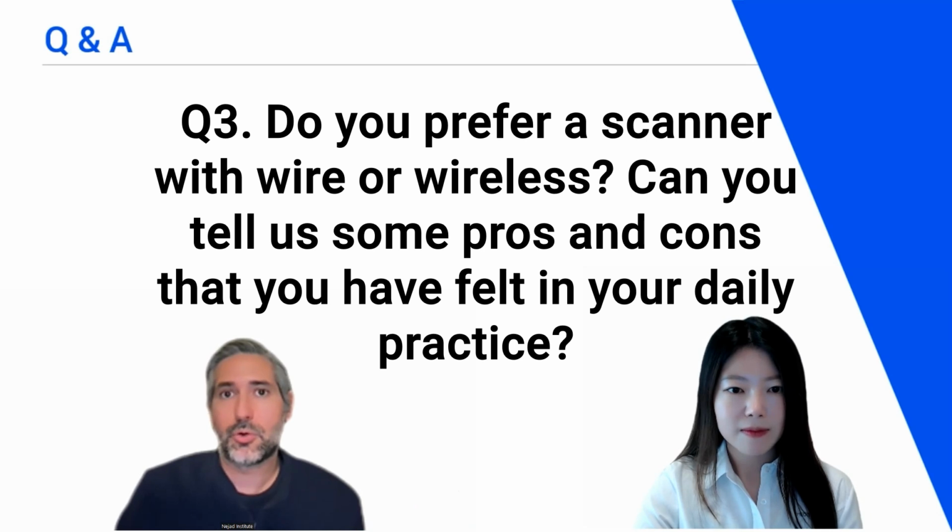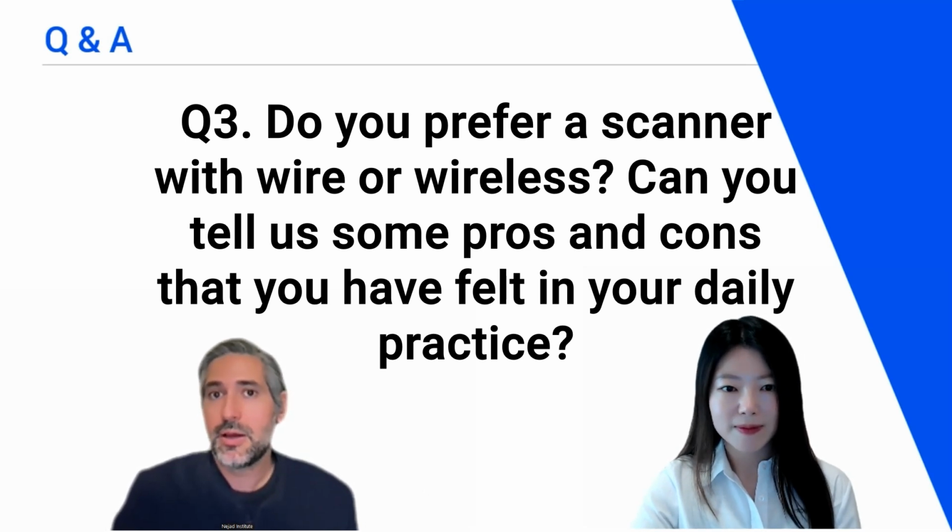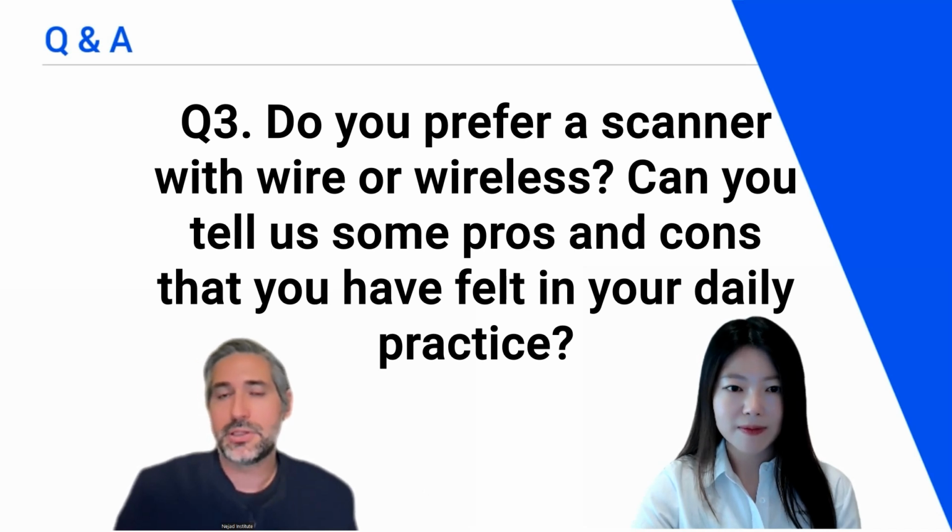If you had to pick a corded scanner, I think more scanners have gone that direction. But I remember dreaming that one day scanners are going to be using just a USB-C or USB connection, and Medit did it first as far as I know. So in terms of the wire, it's not that annoying, but what else could you say about it? When you direct connect, you're always going to get the smoothest everything, but when the wireless is as smooth as it is, it's not a big difference where I'm like, oh, I need that extra 1 second of time to recover. So I think basically it just comes down to the wire.